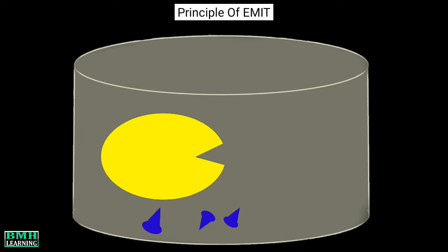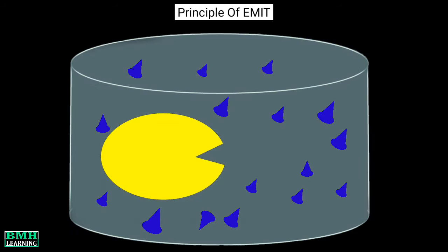The process of substrate binding and releasing will continue as long as the active site of the enzyme keeps on getting the substrate molecules. And a time would come when there would be so many substrate molecules in the solution which have already interacted with the active site and hence have undergone a color change. The change in color in these numerous substrate molecules causes the solution to turn its color itself. And that's what we are looking for, because we use this change in color property in EMIT.